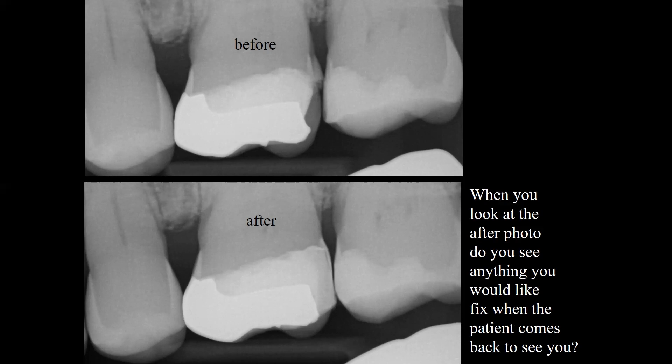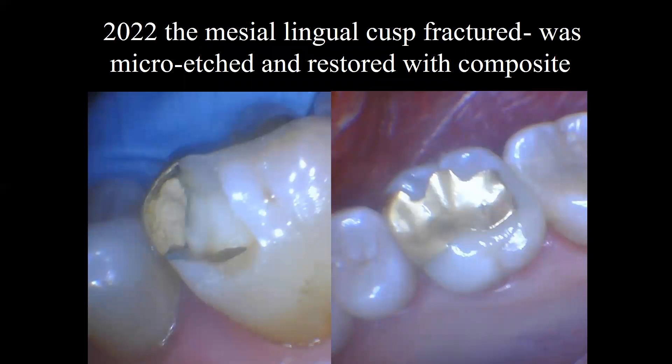When you look at the after photo, do you see anything you'd like to fix when the patient comes back? The only thing that bothers me a little bit is I'd like to round off the occlusal embrasure — it's working the way it is, but that would make it much easier to floss. Later on, in 2022, the mesial lingual cusp fractured on that tooth. The existing inlay was micro-etched, then the remaining tooth structure was etched, bonding agent applied, and a direct composite was done to replace that mesial lingual cusp.